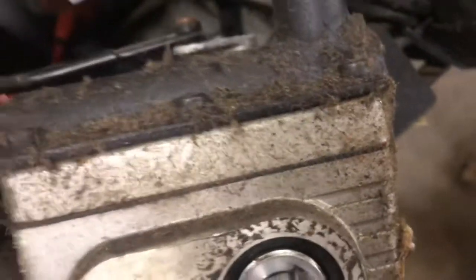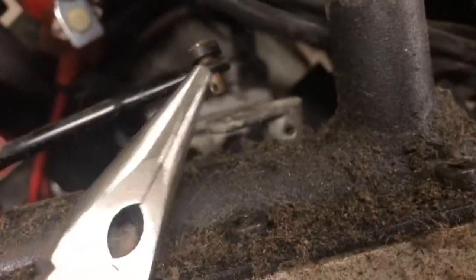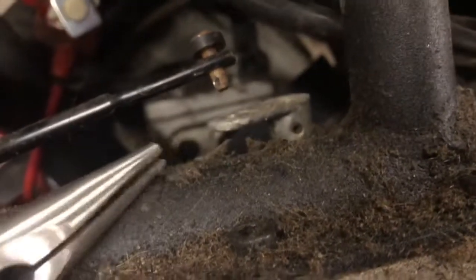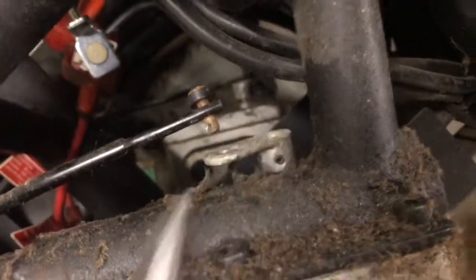So in this case, you could have maybe one or two prongs that go through it. Sometimes one leg goes through, sometimes both legs go through it. What I did was I just flattened it out and pushed it out the other way and it came out. So obviously you could have something a little different, but you see the little hole, so they either have both prongs through it or one. If they just have one, all you have to do is straighten it out and just mash it out. If there's two and they have it wrapped around it, just unwrap it, pinch it, and then grab the other side and pull it out.